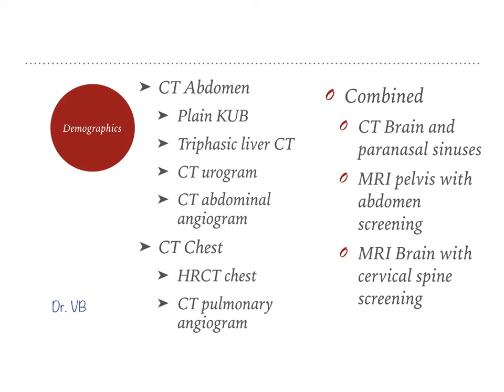In CT chest, if an HRCT chest is done, you can specify it. If a pulmonary angiogram is done, you can specify it as it is. Sometimes many studies are coupled together in a single sitting itself, so it might be a better idea to give a common heading if you are planning to incorporate both reports together in a single report.